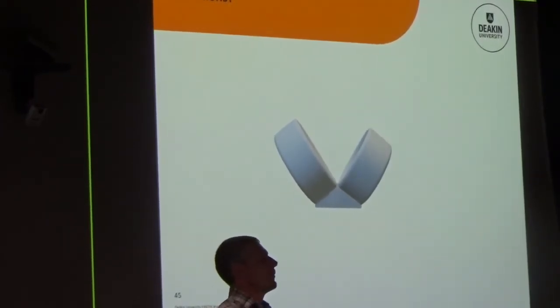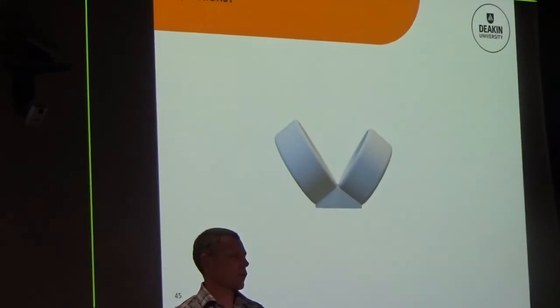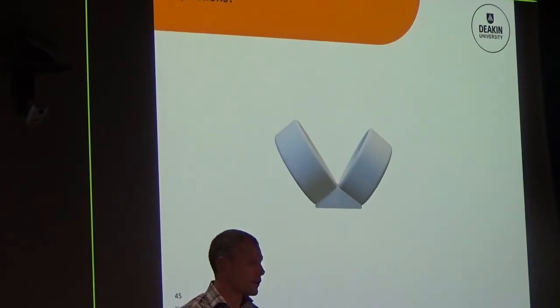Another question: how long would it take to print out? Good question. Again, my printer's now a couple of years old and a slow one. These splints took 29 to 32 minutes in total. What we did for the research was we got the person in, consent to them, I measured their finger, and then I went off, changed the dimensions, pressed print, then I went back, they did their baseline measures, then I moulded the thermoplastic one. By the time we'd done that, the 3D one was printed, and then they could go up. We didn't have to get them in and out. But for a tiny, small splint, it was 32 minutes.